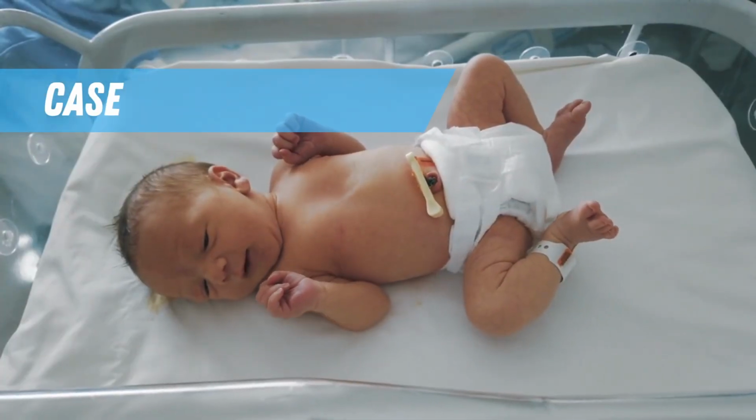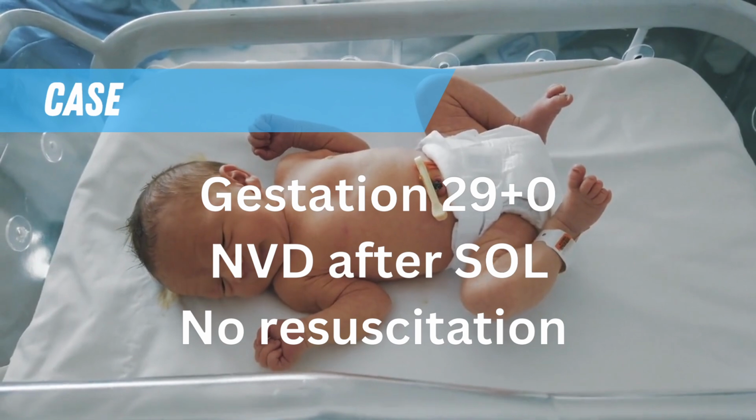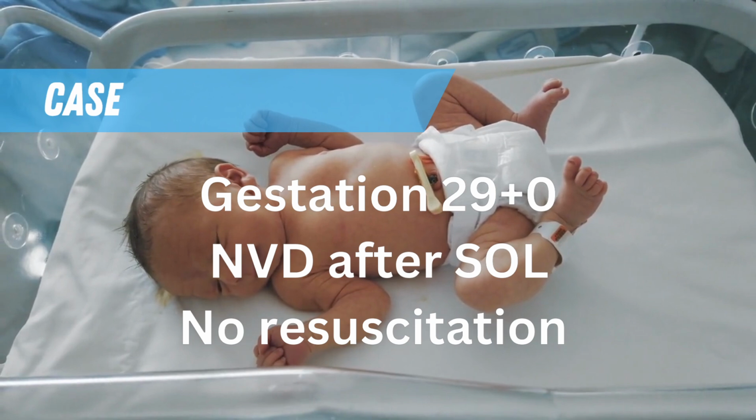In this video, we will consider a case of a baby born at 29 weeks gestation by normal vaginal delivery after spontaneous onset of labour. The baby cried at delivery and no resuscitation was required.